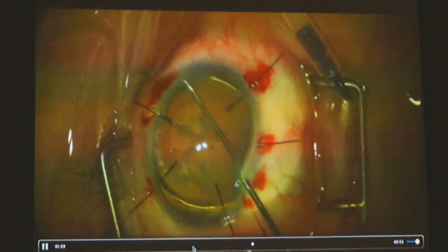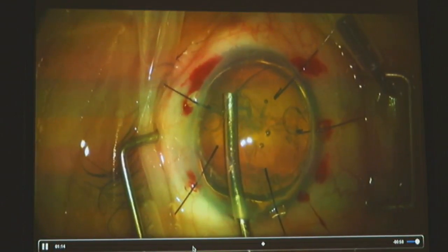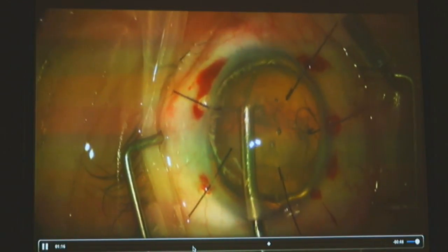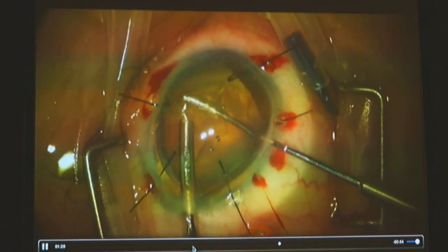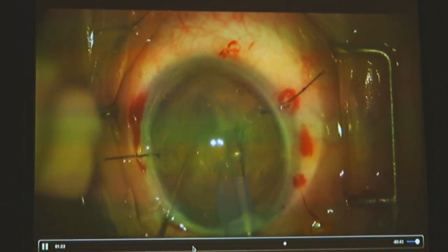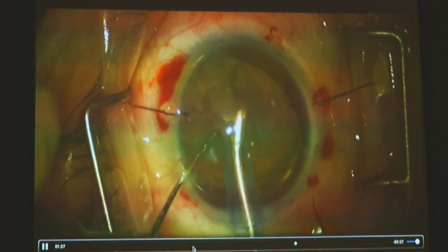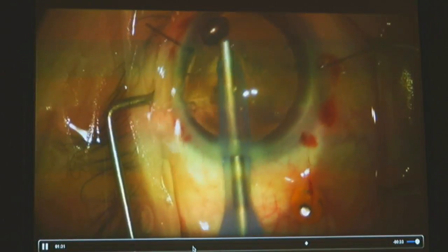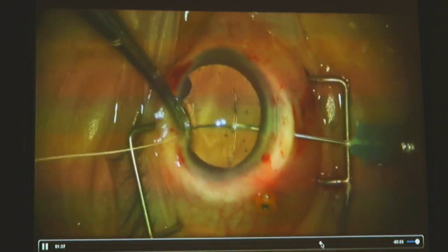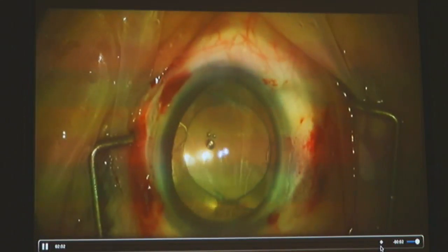Now, I have an oath I make when I do surgery. As you can tell, my bias: I do whatever I can to preserve the capsular bag, because there's no better place for the lens. Sure, we suture lenses to the iris, to the sclera, ACIOLs, but there's no better home than for the IOL to be in the bag. So there we pass our sutures through the segments on both sides, two of them, and now we have a lens nicely positioned in place as well.